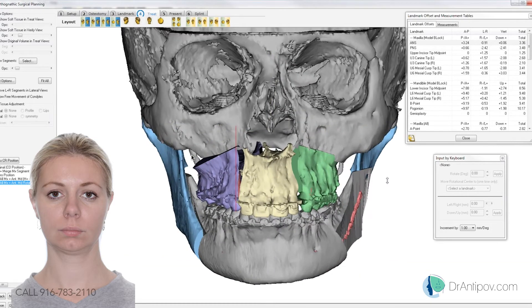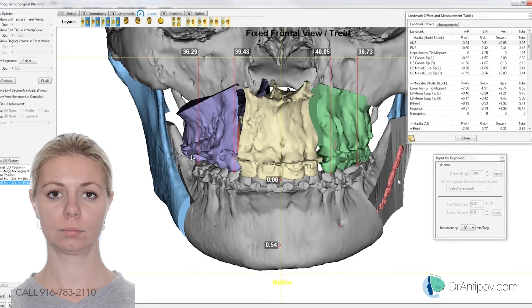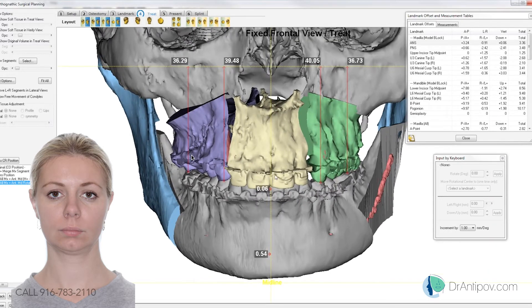Zooming in a bit — you can see that our upper dental midline is pretty much on the facial now. We're looking pretty level in that anterior segment, and at our canines and molars we're about a half a millimeter discrepant. Overall, kind of splitting the difference. She has a difficult occlusion with multiple missing teeth, so that's acceptable.